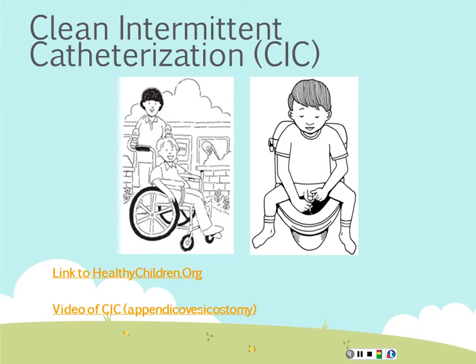What I'm going to show you real quick is a video of an adult patient with an appendicovesicostomy cathing herself. One version of it is called a Mitrofanoff, and that's what you're going to hear her describe, but it's pretty much an appendicovesicostomy. So we're going to pull up this video real quick for you to see.